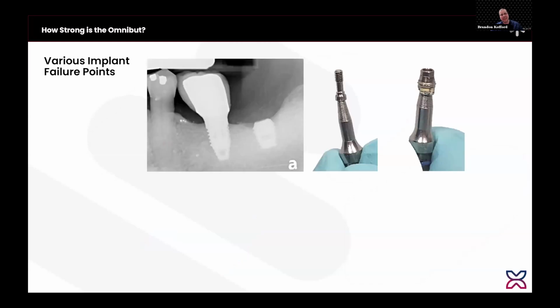Okay, this is a case I treated just yesterday, and my partner treated today, recovering broken or failed implant components. So in the X-ray, you see a bicon implant with a fragment still in the chamber of the bicon implant. It's not a screw. It's just a friction fit, right? So I have to just retrieve that fragment. So I drill into it, and then I use an extractor tool.